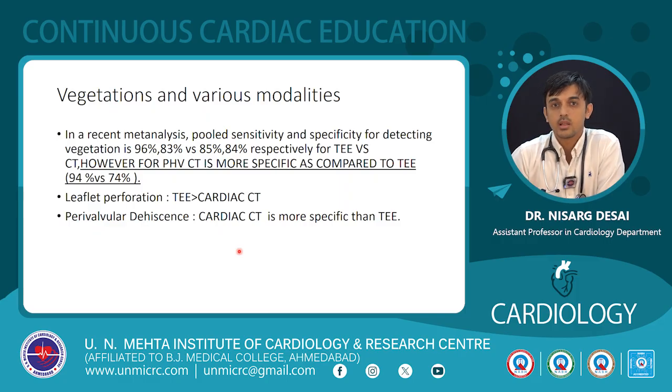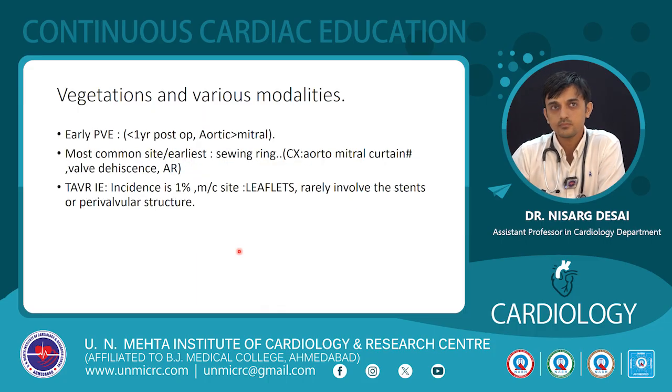However, it has to be noted that if we are evaluating a leaflet perforation, TE is slightly more sensitive and specific than cardiac CT. But for perivalvular dehiscence, CT is more specific than TE. So which pathology we are analyzing, accordingly the modality of investigation should be focused upon. That is, if we are suspecting a leaflet perforation related MR, TE is better than cardiac CT.